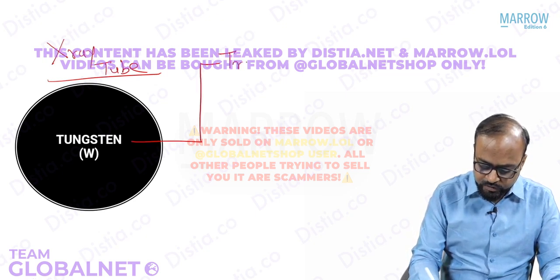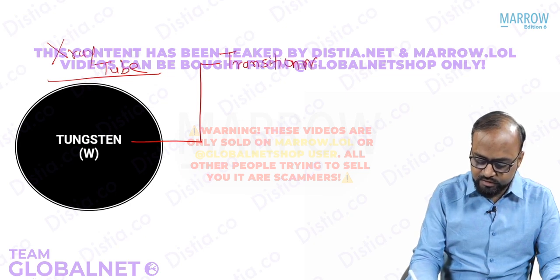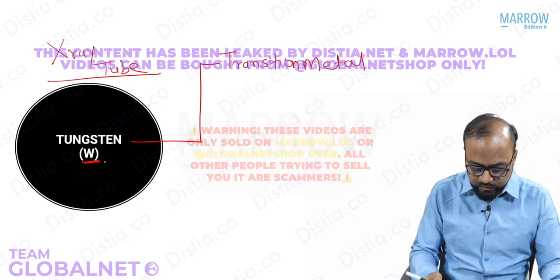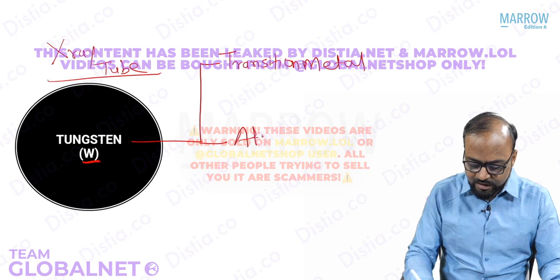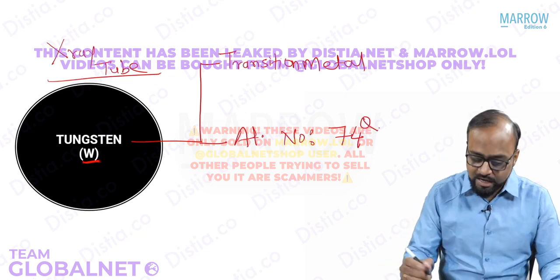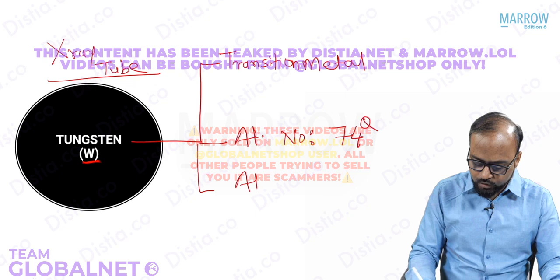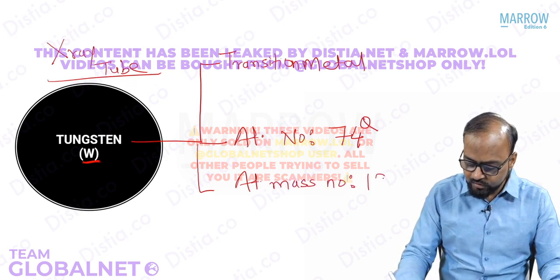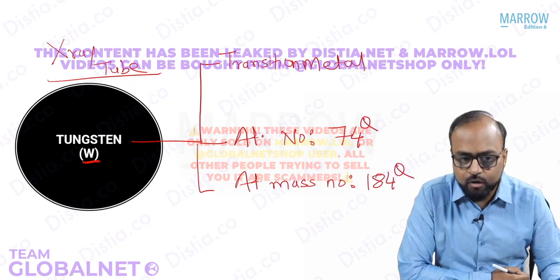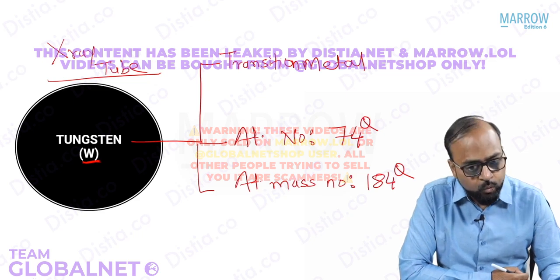Tungsten, remember, is a transition metal, classified in the periodic table as a transition metal. It has a symbol of W and an atomic number of 74. This was asked as a question in one of the JIPMER pattern exams, and it has an atomic mass number of 184. So few things about tungsten that we must know: transition metal, atomic number 74, atomic mass number 184.